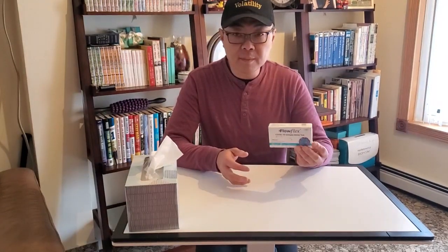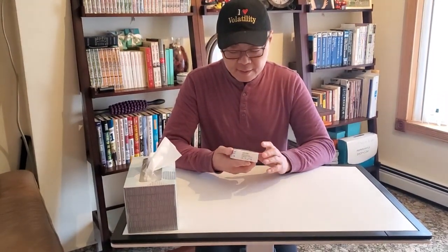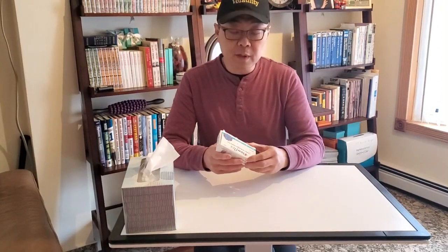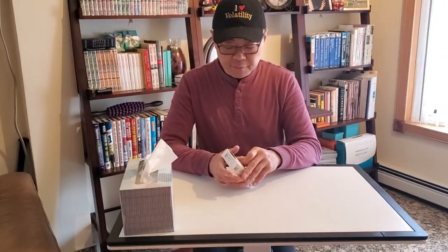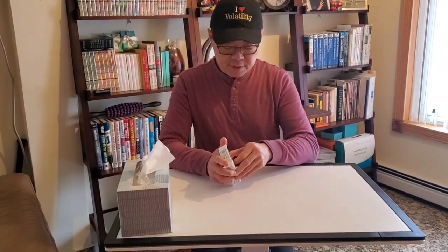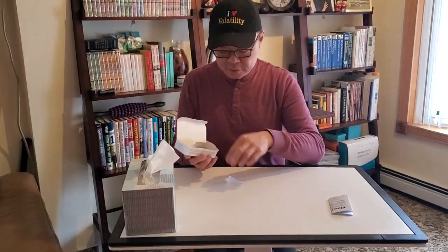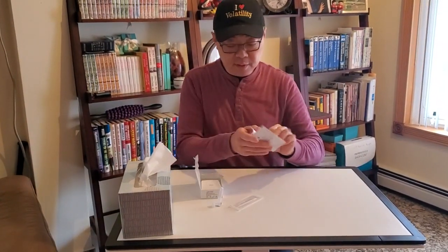This is what we got from Rite Aid. It's FDA approved and this is a one-test kit, FDA approved for one test. I did it for my wife already so I have an idea of what to do. Unlike the other videos, the FlowFlex they have in England has a holder — this one doesn't. First thing you'll notice is when you open up the box, you have instructions in English and in Spanish.